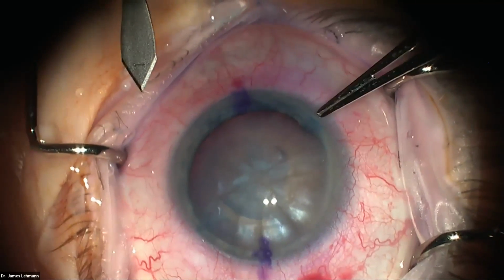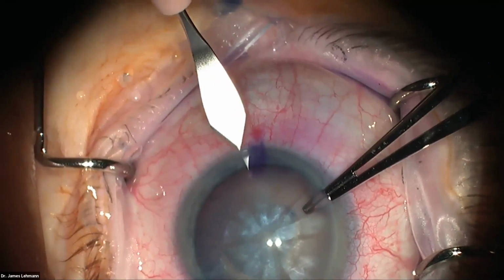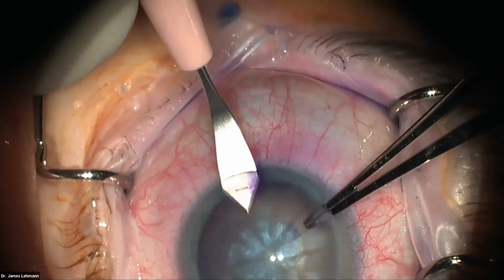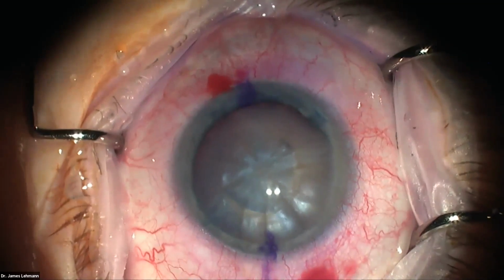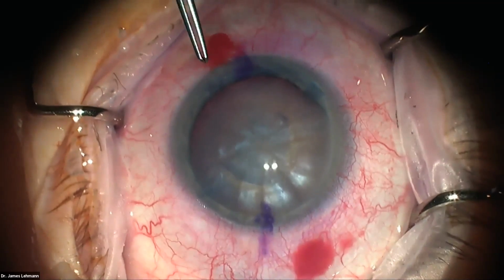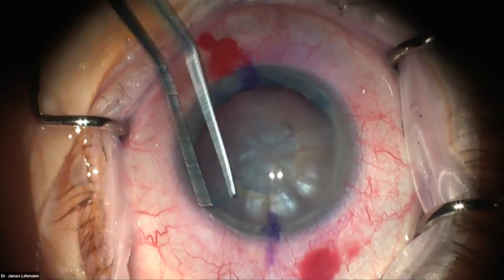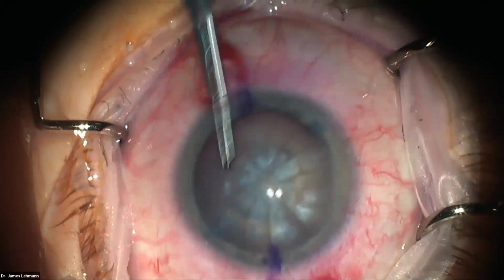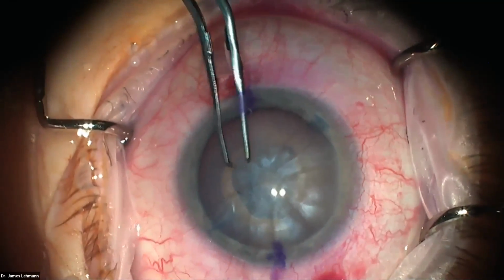So again, I stabilize the eye by closing the 0.12s and then going right at the limbus, and then in one step going in just to that mark and then out. You can see the bleeding there at the wound. That's what we like to see. And then we're going to go in with the Utrata forceps, and we want to make sure there's no tags. That's the main thing. So I'm going to grab where it's already up like that, and you can see it being pulled there.